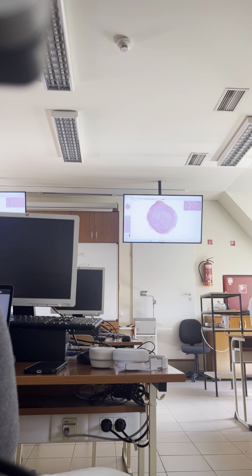Okay, so downward we have the ventral side, upward we have the dorsal side, and ventrally we have this kind of tissue called corpus spongiosum, into which the urethra is embedded. Because the urethra is embedded into the corpus spongiosum, this is the spongy part of the urethra, also called the penile part. And the lining epithelium here is characteristically stratified columnar.